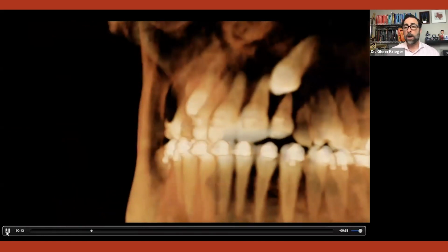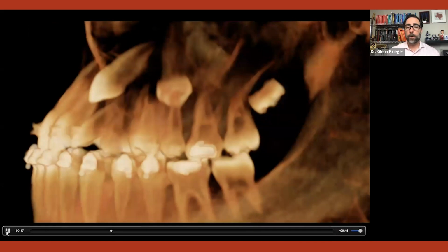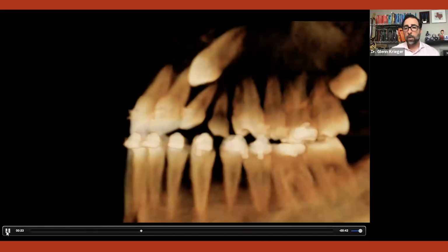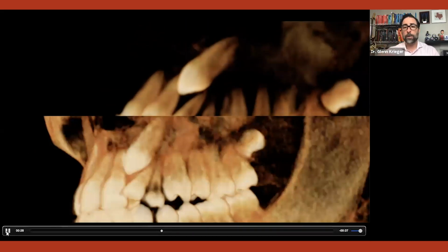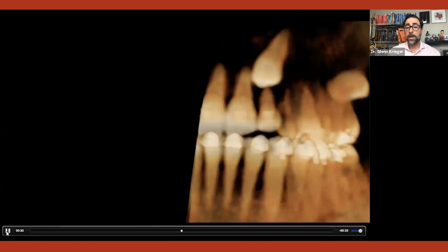Now it's time to take out that primary cuspid. Now it's time for me to let that lateral incisor stay mesial while we put a chain on the cuspid and bring it distal a little bit more. And again, I can get rid of the opposite side so I can really see what's going on there. And if we go back to where we started as a superimposition, not a true superimposition, but for you to be able to see them both, you can see we created room, which for me is the name of the game.